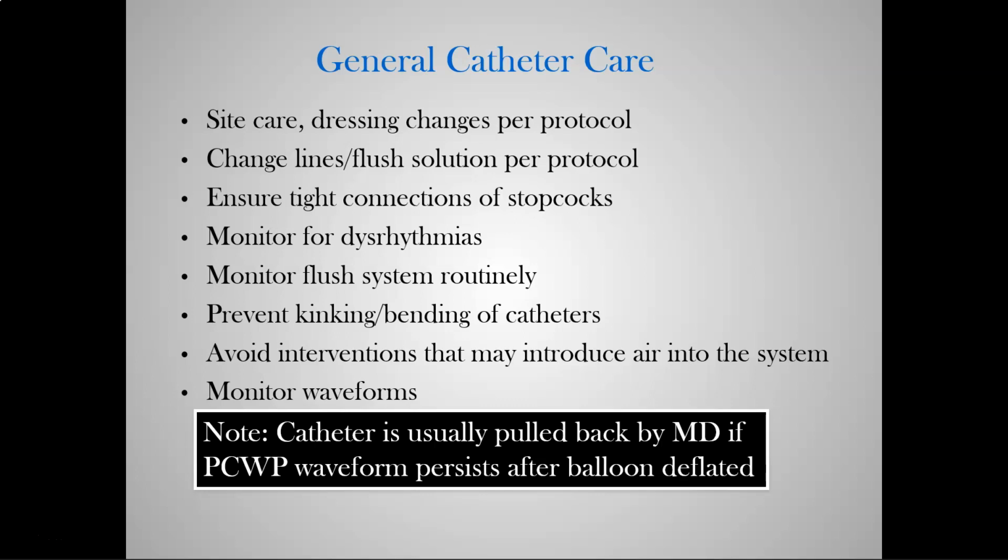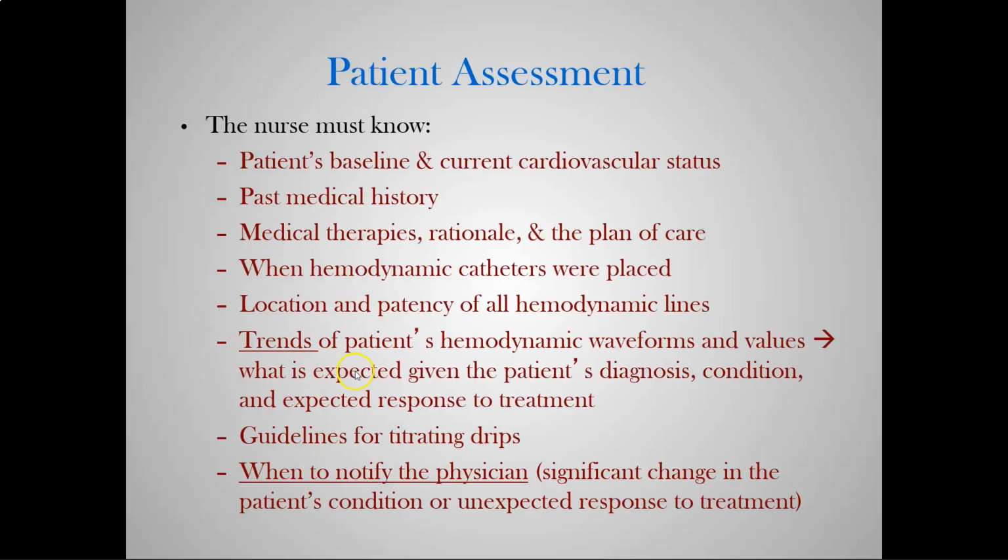All right, and then you're gonna take your dressing off. There's markings on the actual catheter showing you where. And then all right, 2 centimeters back, okay, or 20 millimeters, whichever comes first. 20 millimeters. And then we're gonna pull it back and boom, we're where we wanna be in place. Okay. And that's pretty much it.